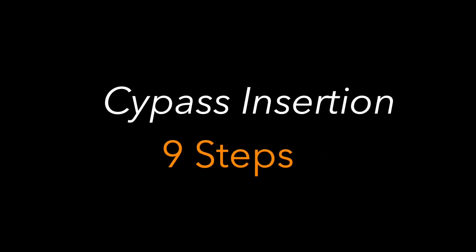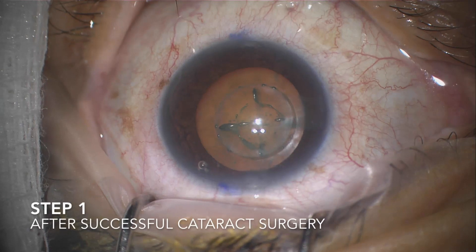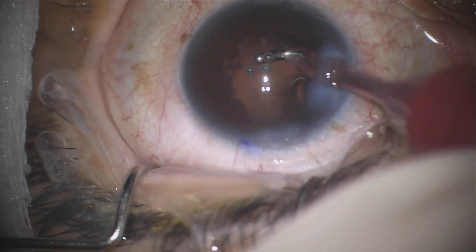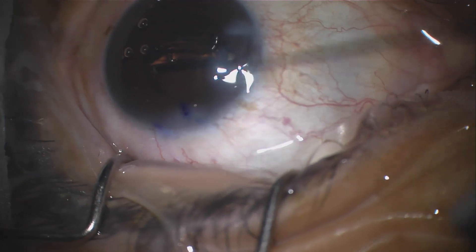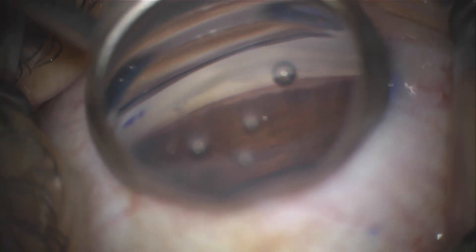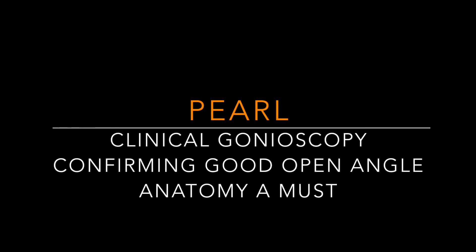Moving on to successful CyPass insertion. Step number one is successful cataract surgery. The cataract surgery needs to be performed first, different from other MIGS procedures, because once the CyPass is inserted in position, there needs to be care to make sure it does not get dislodged. Step number two is to have a clear gonioscopic view of the angle. There should be a clear view specifically of the scleral spur, as this is an indication — prior in the clinic setting — to make sure that the patient is a good candidate.